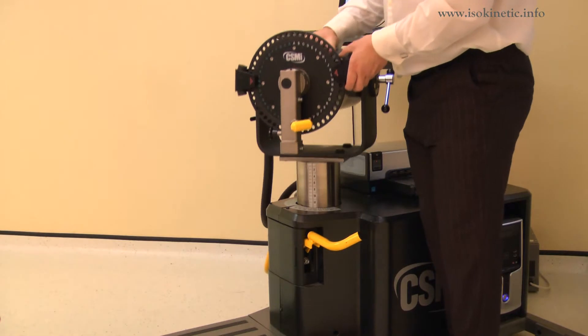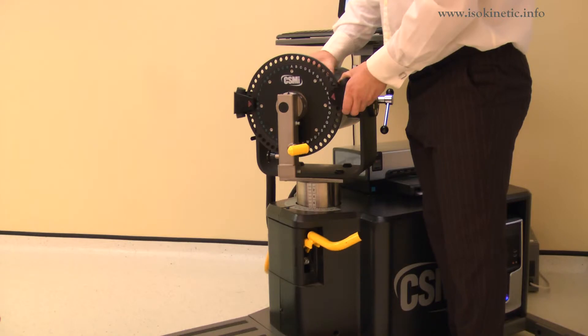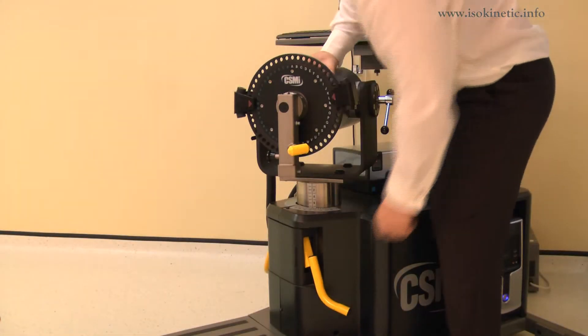Lift a locking handle to release. Rotate the dynamometer to 10 degrees on the black scale, whilst also adjusting the height to position 28 and a half. Ensure both locking handles are pushed down to secure.